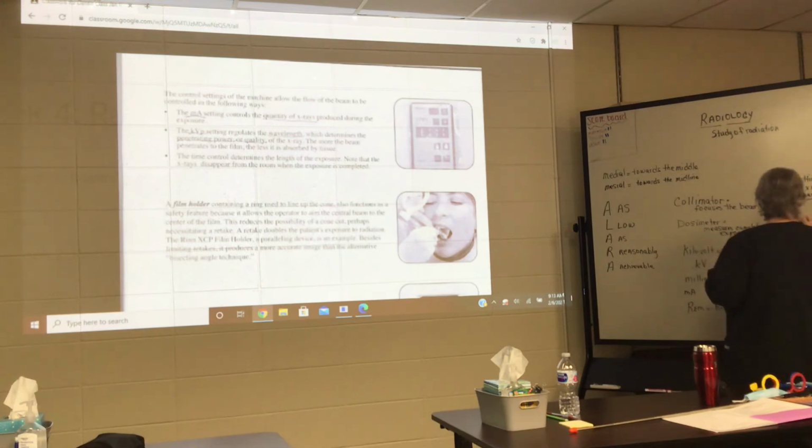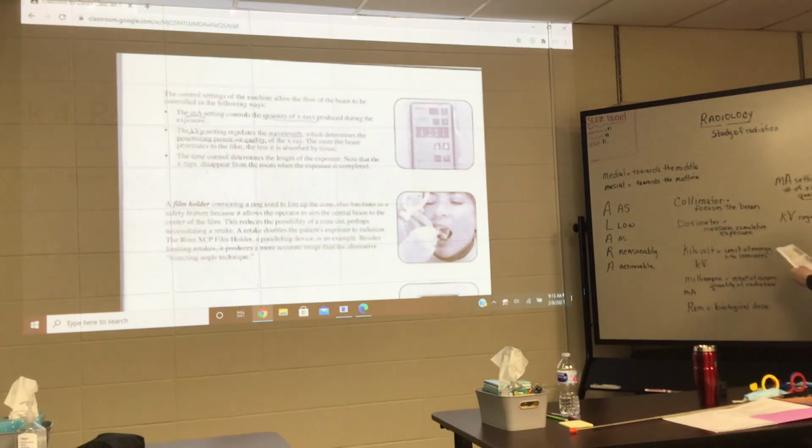The KV regulates the wavelength, penetrating power, or quality. The word that you need to associate with KV is quality.